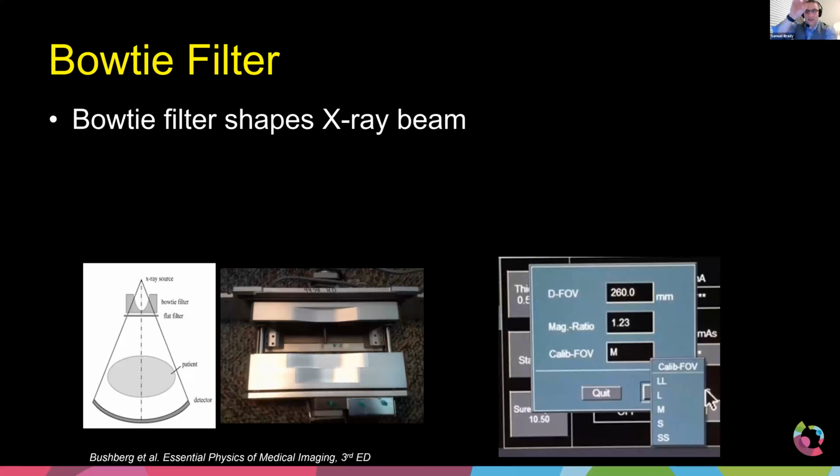The photons, the X-rays are coming out of the tube, and the very first thing they're going to do is pass through this filter. We call it a bow tie filter. It looks like a typical bow tie that a gentleman might wear. And the reason we have the specific shape of this filter instead of it being just a flat filter is that we are typically oval in nature. We have a very generically elliptical shape, especially in the body, because we're talking body.